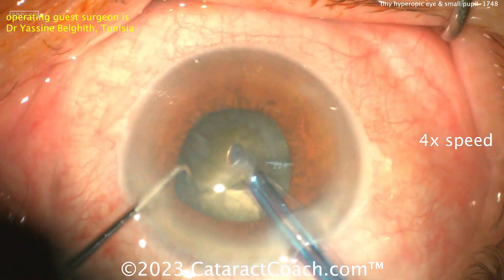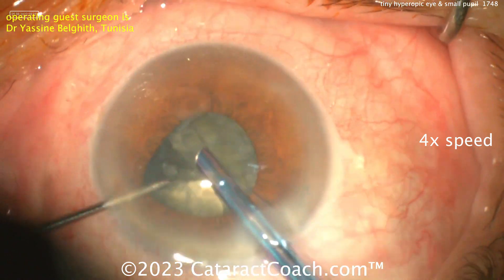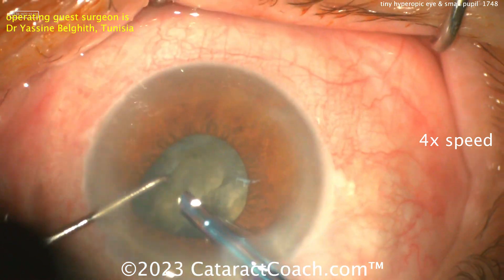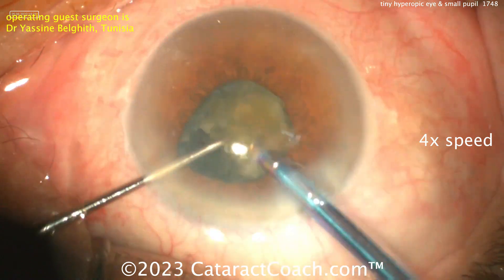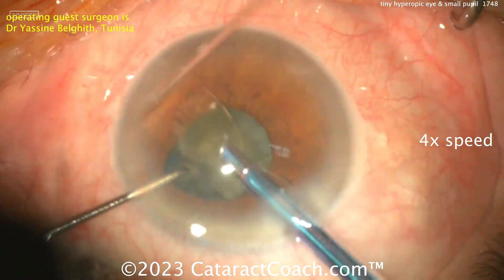Look at the iris already wanting to prolapse out the paracentesis — it's kind of peeking in that direction. And look at the pupil coming down; the dilation is smaller now. Beautiful chop technique, by the way — very nicely done.